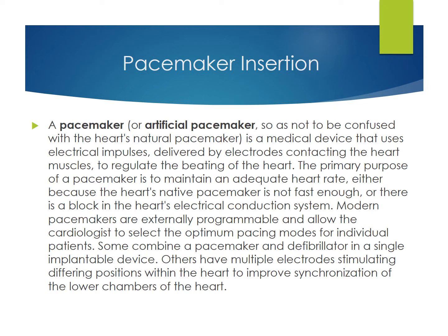Pacemaker insertion. A pacemaker, or artificial pacemaker, so as not to be confused with the heart's natural pacemaker, is a medical device that uses electrical impulses delivered by electrodes contacting the heart muscle to regulate the beating of the heart. The primary purpose of the pacemaker is to maintain an adequate heart rate, either because the heart's native pacemaker is not fast enough, or there is a block in the heart's electrical conductive system.